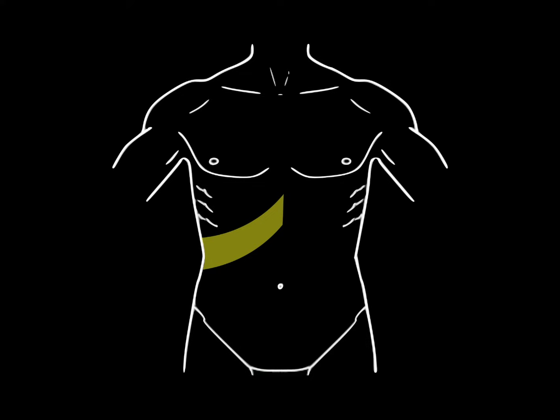If that doesn't work, you're going to start looking through the ribs right here. There's a spot right there to look. That gets pretty difficult, so unless you've done this a lot, you may want to have a consultative ultrasound at that point, or look at other imaging modalities. But that can occur if you develop that skill.